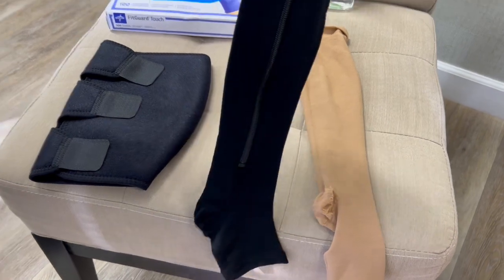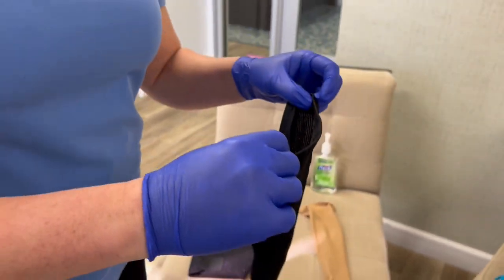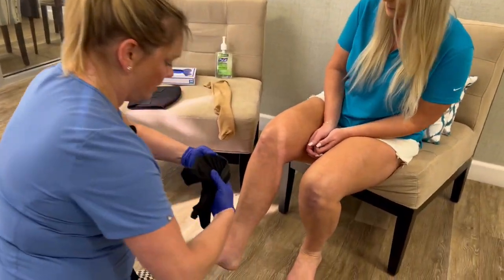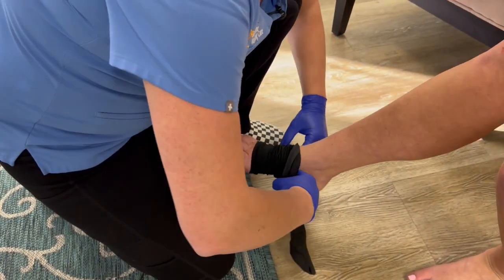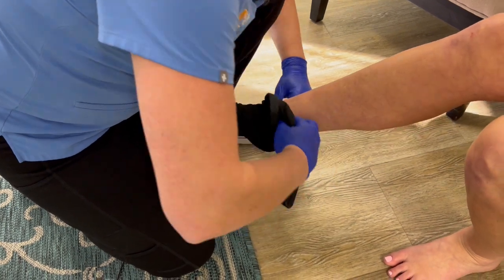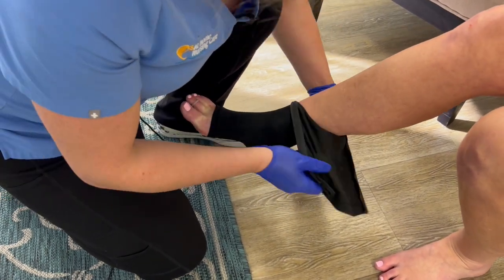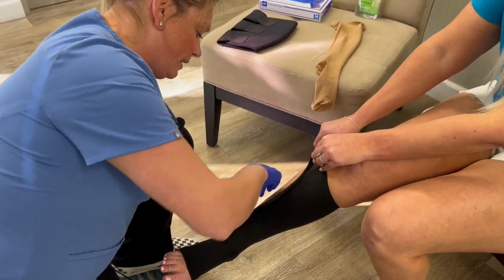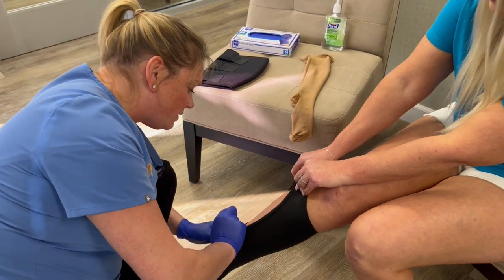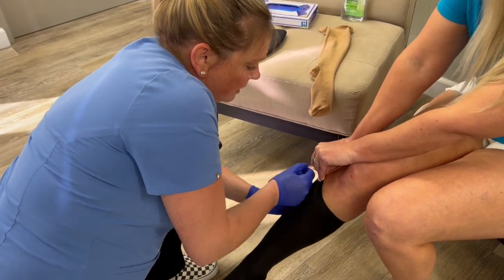Now we're going to try a zipper compression stocking. These can be easier but are sometimes a little harder to get around the leg to zip it up. You can start with the wide toe base, get over the heel, being careful with the zipper. I'm going to have my patient help and hold that, and I'm going to pull it gently away from the skin as I zip up so that we don't get any skin in the zipper.